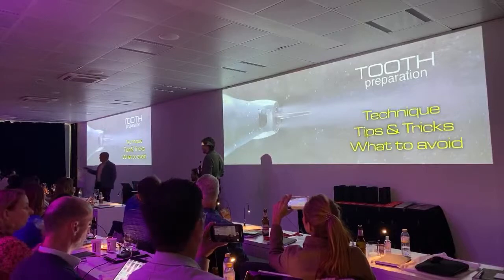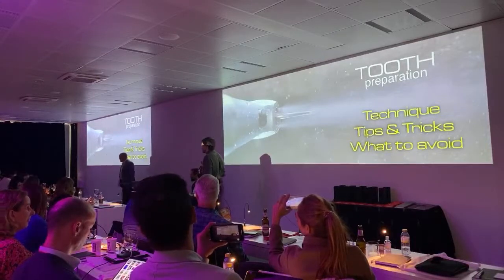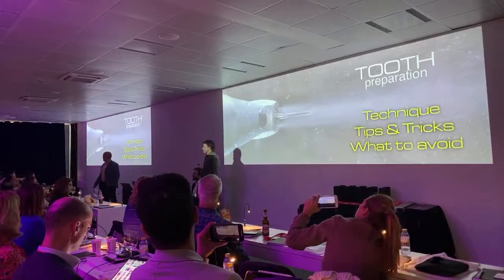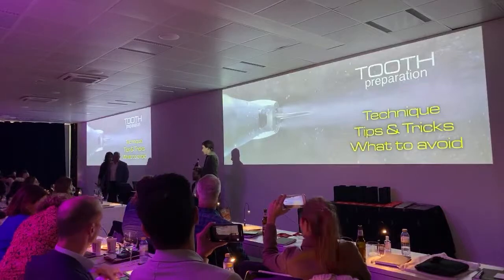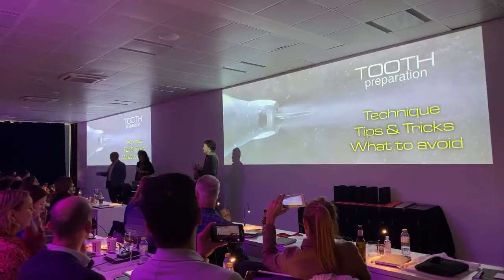Or chairside restorative, you need to send to Costa Rica and so on. No, we are already working on it. They're going to change that, but for now, with iTero, you need to cheat the system, and you need to scan your preps in iRecord, immediately send to us, and in 10 minutes, we give you feedback.